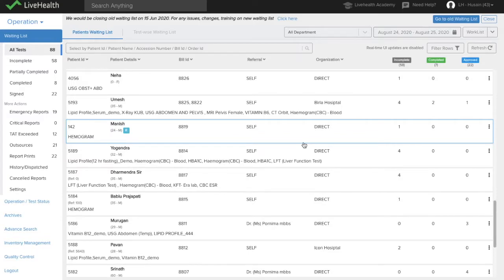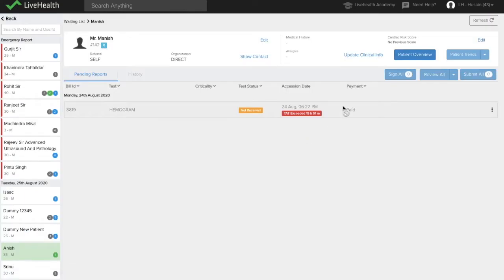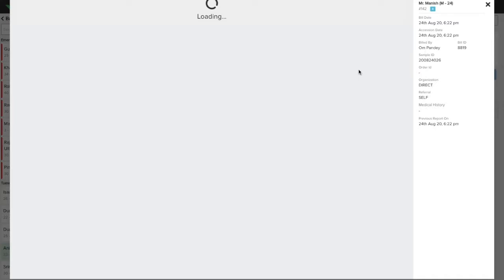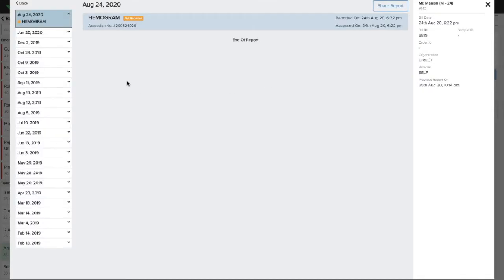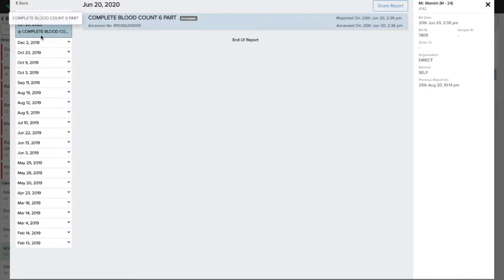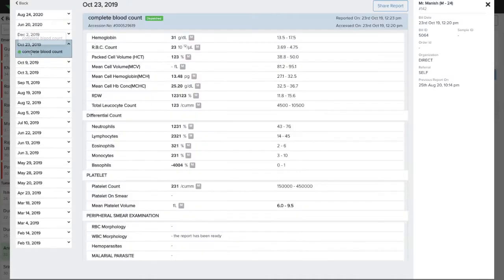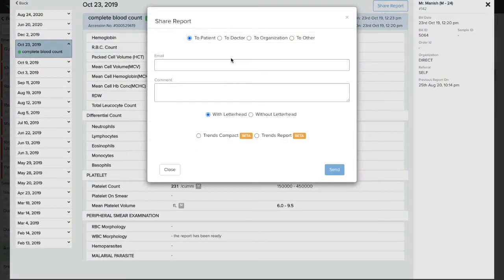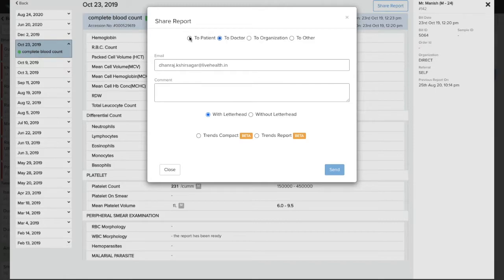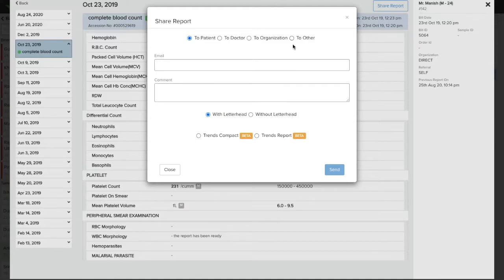In the patient-wise view, if I open, I can see in the patient overview any older reports if the patient has. I can see the share report option to send the reports to the doctor or to the patient manually. If I want to send it again or any other person, if I get the email later on, I can send it from here.